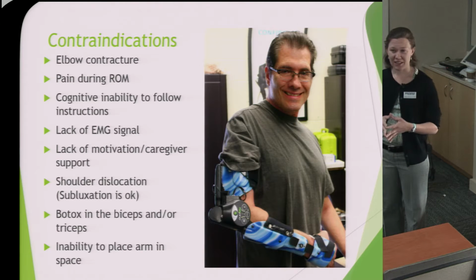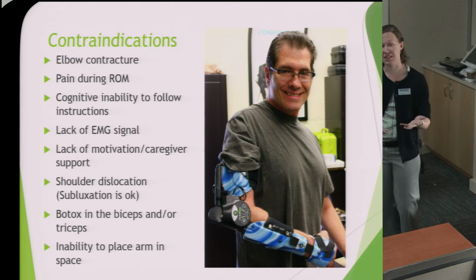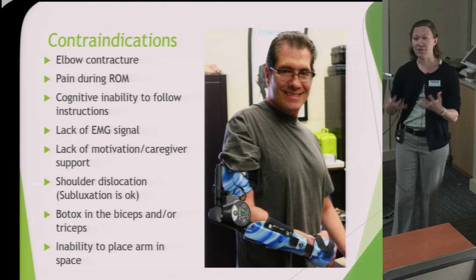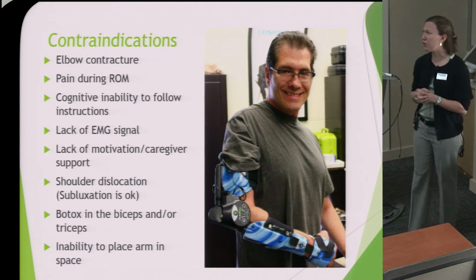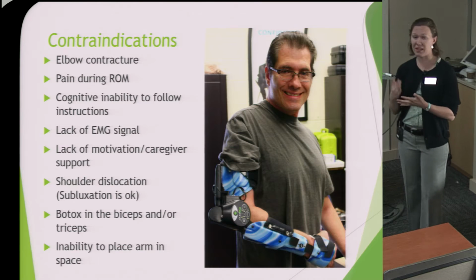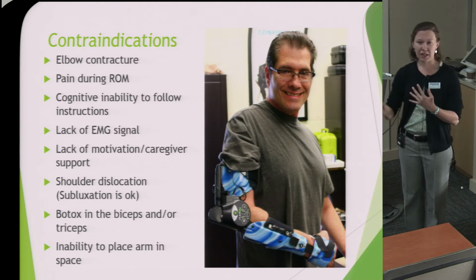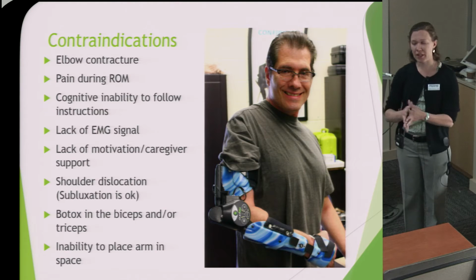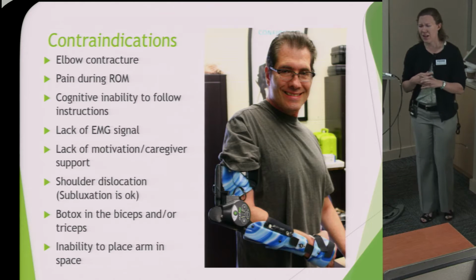What happens is basically every week as the Botox starts to wear off, you get a different EMG presentation. So you get a different functionality of the orthosis every single week. So it's very frustrating for patients, and we do recommend that they discontinue it, again, just in the biceps and triceps. They can still get it in the wrist, in the hand, in the shoulder, anywhere else you want them to get it, just in that one localized area.